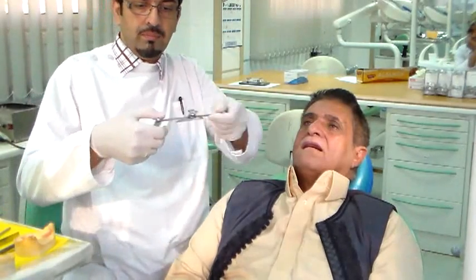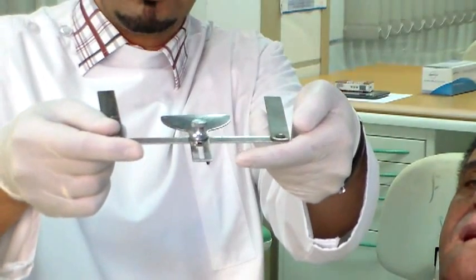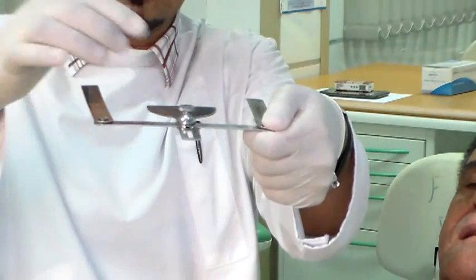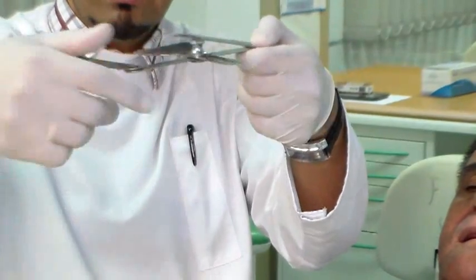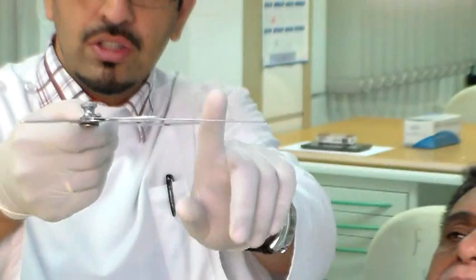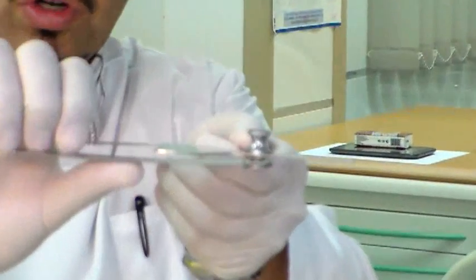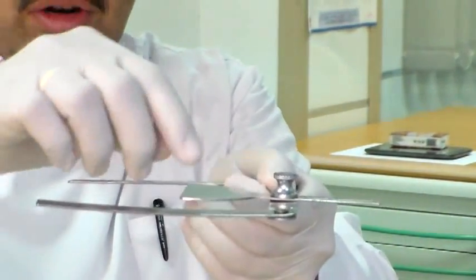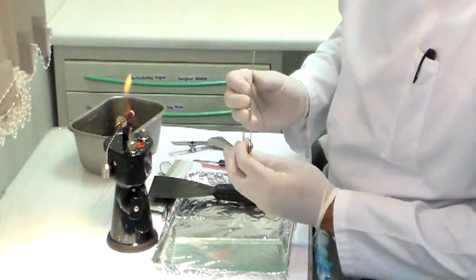Sometimes with metal Fox planes there is a problem: the metal Fox plane tends to be bent, or sometimes the fork tends to be bent and the arms tend to be bent. You need to verify this. You can see one arm is bent but the other arm is flat — that's good. But the bent one is definitely going to give you a wrong reading on the camper's plane. You need to correct this bend before you do anything, on a table or a flat surface. I can see there's also some problem with the bite fork.